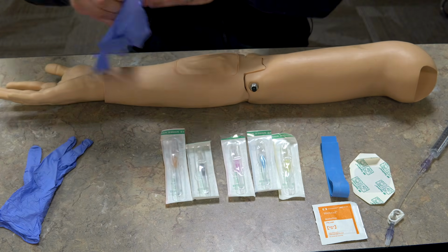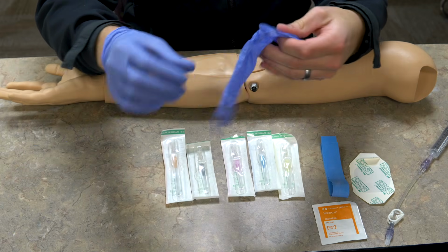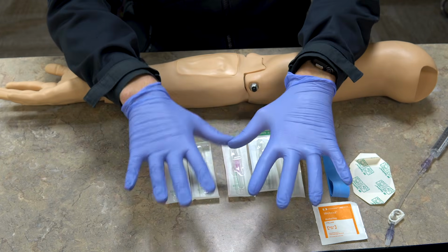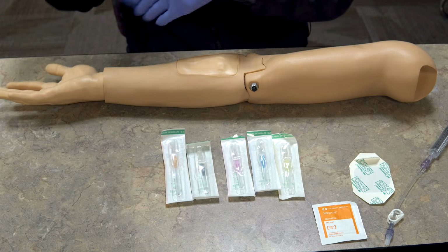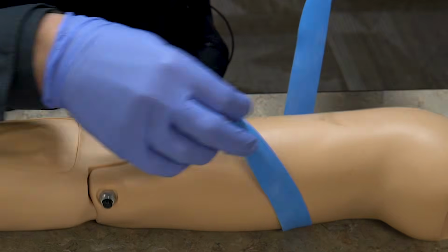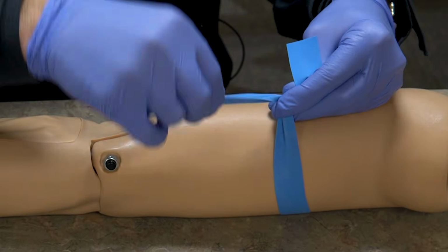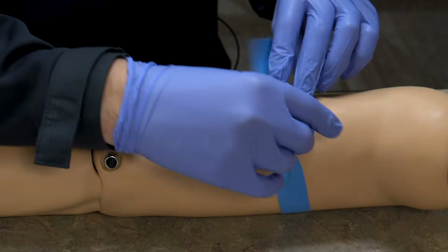So now, before I touch the patient, I'm gonna don my gloves because we're gonna be dealing with blood and you wanna be safe. Usually skin is a pretty good barrier, but if you're doing this professionally, starting IVs, you should always have gloves on. And what I wanna do now is take my tourniquet and put it on the upper part of the patient's arm. When you tie this, you wanna tie it in a way that it can be undone with one hand. So I take this, I make a loop under, but I don't pull it all the way and let it sit on the skin.